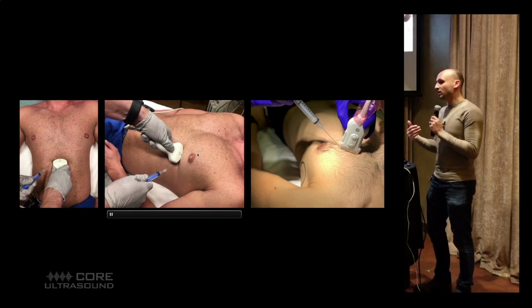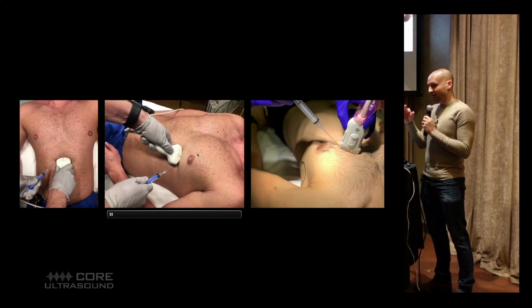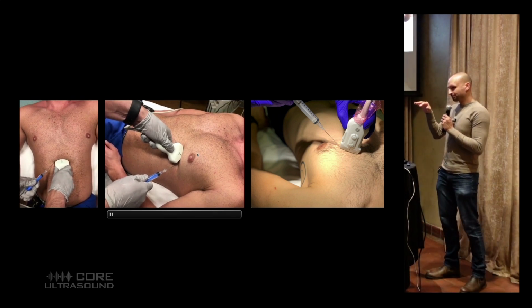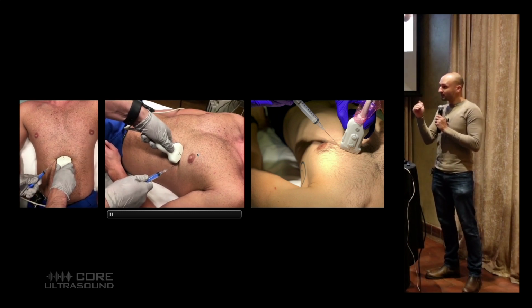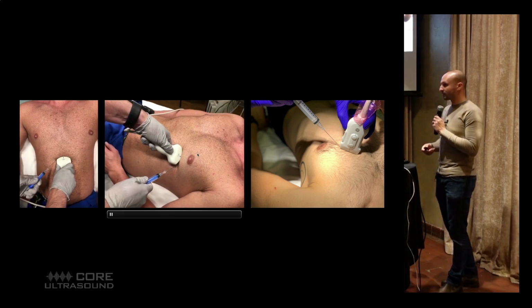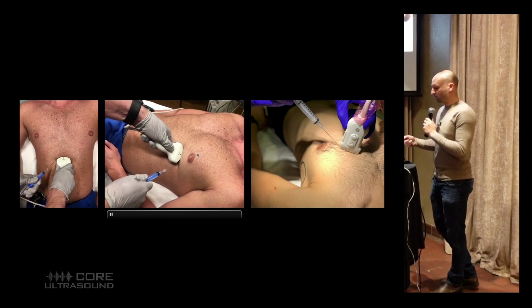Whereas if you go apical or parasternal for your view, you're not gonna poke anything but that pericardium, as long as you got good visualization, obviously. If you can see the pericardial effusion, there is no lung between the skin and that heart, right? Because if there was lung in between, you wouldn't be able to see it because lung blocks sound waves. So next time you have a patient that you're evaluating for a pericardial effusion or pericardiocentesis, look at your parasternal long, look at your apical 4.